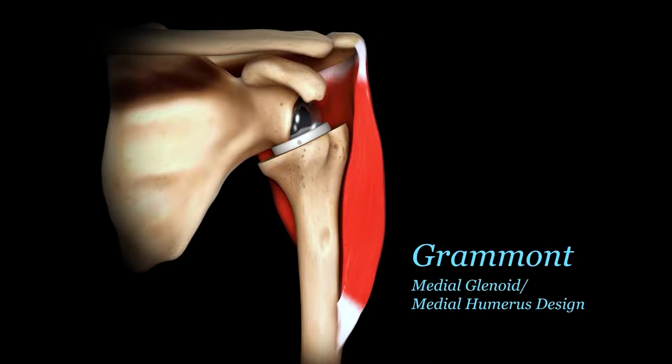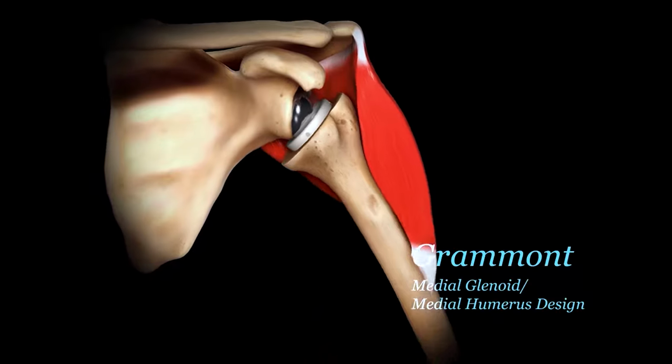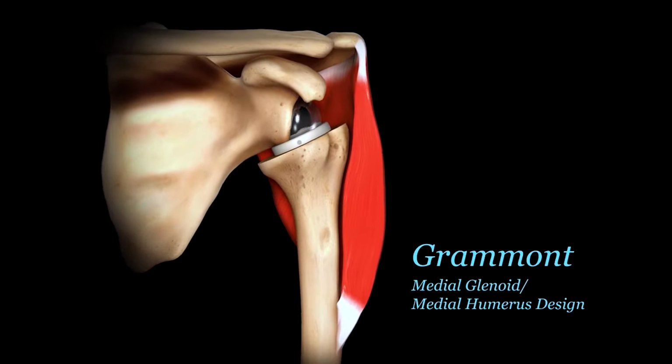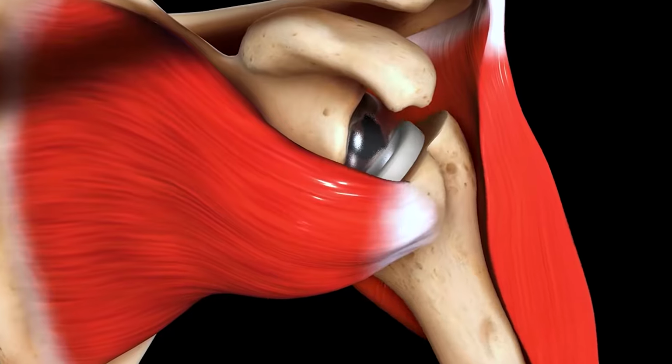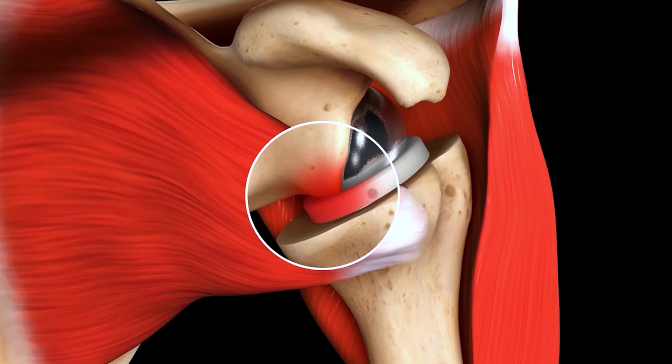This implant design and resulting humeral positioning is effective at restoring active abduction and forward flexion, but is less effective at restoring active rotation. Grammont's medial positioning is also responsible for a low glenoid loosening rate, but a high scapular notching rate.